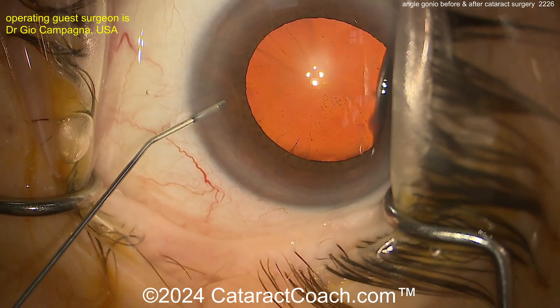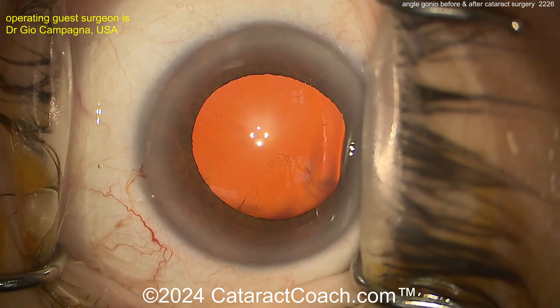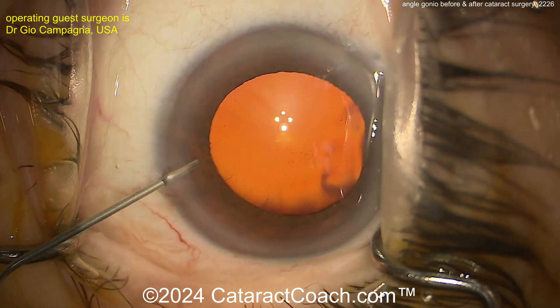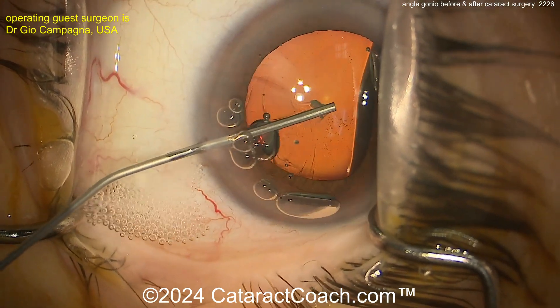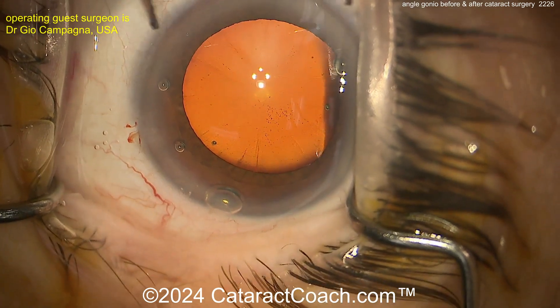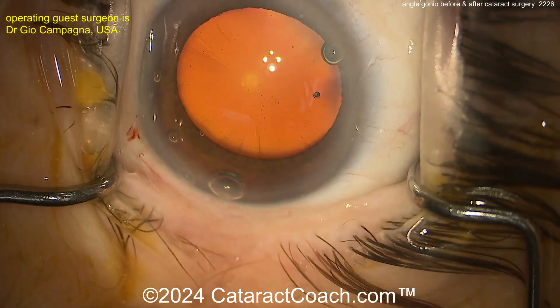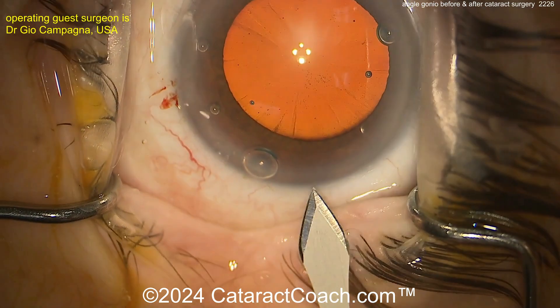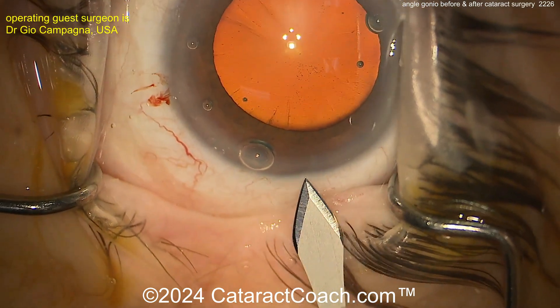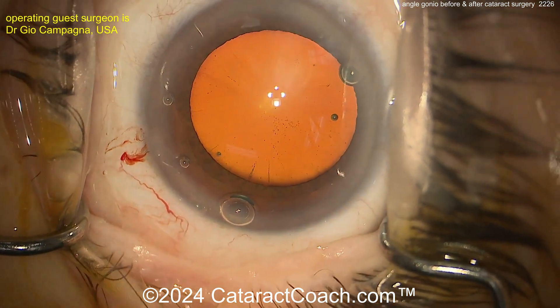Now doing the cataract surgery — what's different in these cases? Obviously, you have a shallower anterior chamber. A little trick here: maybe loosen up that speculum a little bit. Sometimes if you really crank the speculum open, that can exert some posterior pressure and make it a little more challenging. The video is sped up so we can get through the whole thing. Nice-looking single-plane incision.